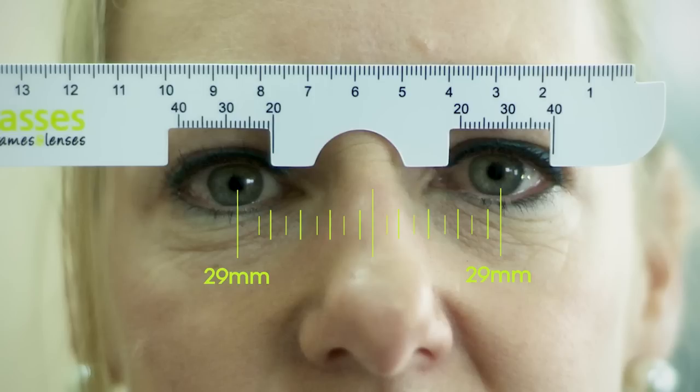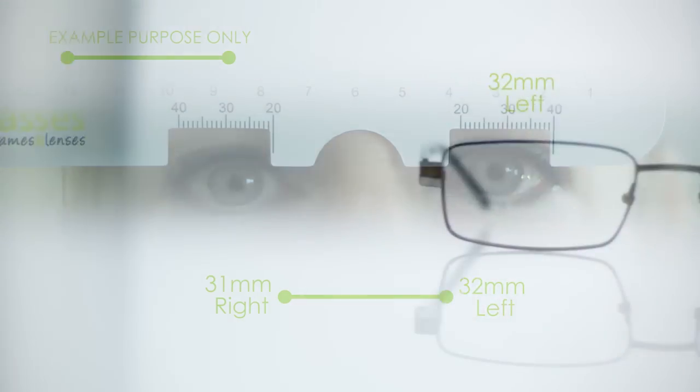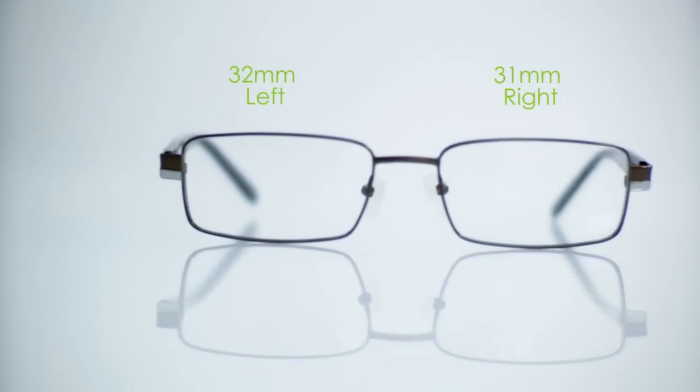Now add these numbers together to get your PD measurement. If these measurements are not the same for each eye, for example 31mm for the right eye and 32mm for the left eye, then record the figures separately so we can ensure your lenses are perfectly centered for each eye.